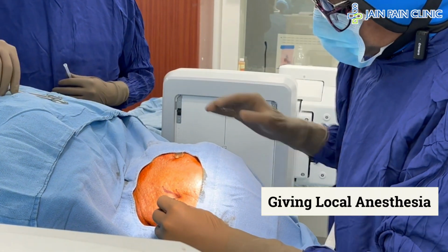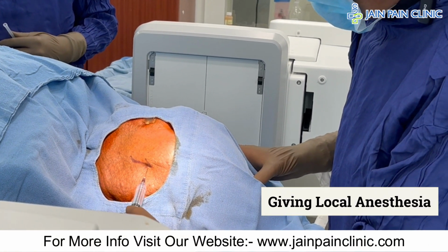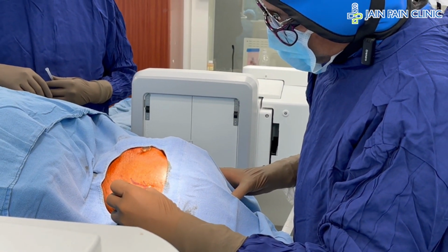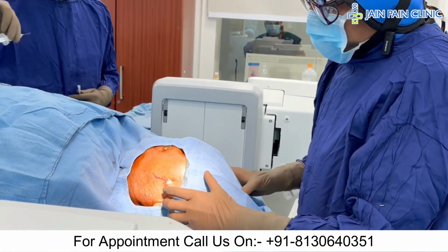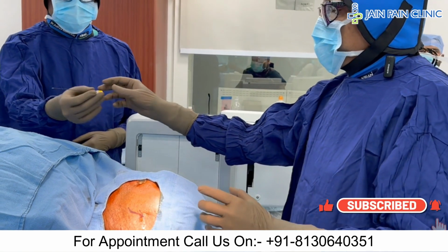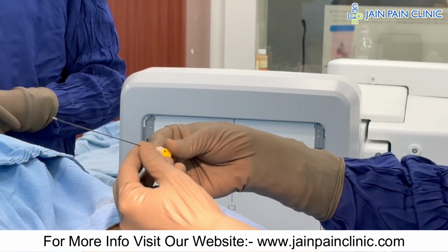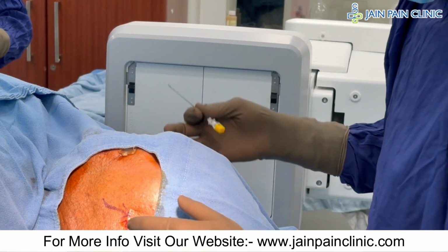In Sphenopalatine, you have to go out of plane because the coronoid notch is lying posterior to the Sphenopalatine Ganglion. So I have given local. Again I will feel the notch here. Now for this we will take a 10-5 RFA needle. It is yellow in color, 5 mm active tip, 10 degree bend.